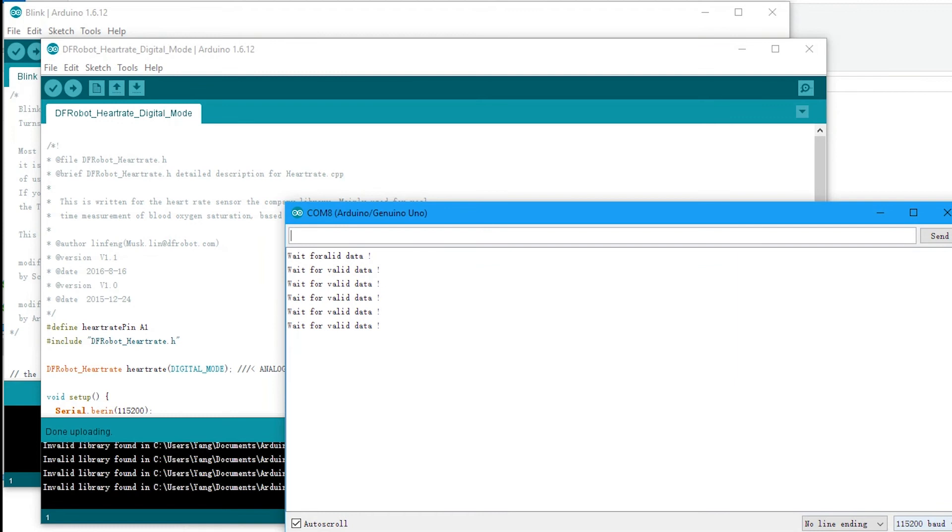Now the heart rate is being updated in real time. Upon a beat pulse is detected, and real-time heart rate will be displayed as a number in the serial monitor.